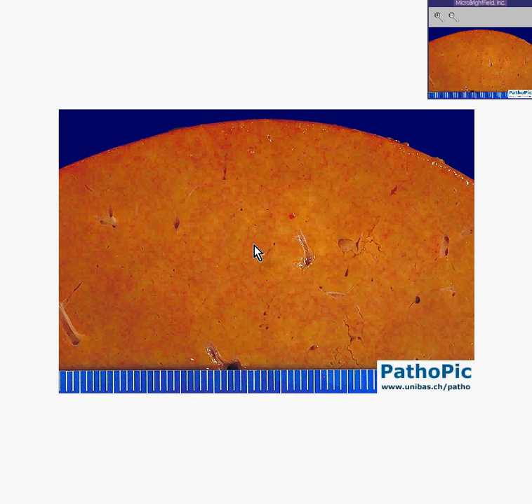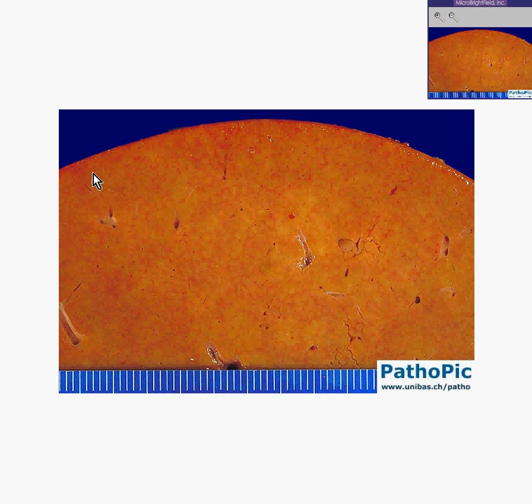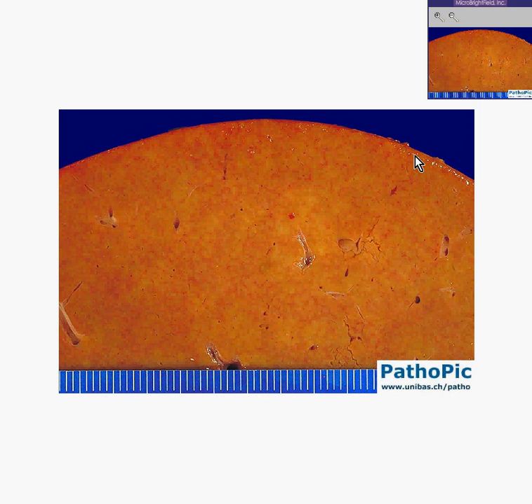Here is a liver. You could instantly recognize that. It has a very nice smooth surface. You can see part of the glistening capsule here. You notice this is the cut surface.